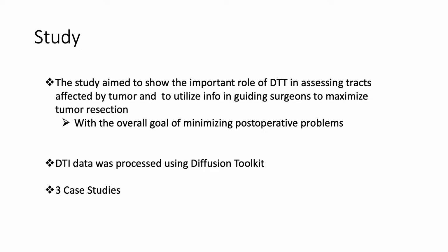The study discussed in the present paper aimed to show this important role of DTT in assessing tracts affected by tumor and to utilize this information in guiding surgeons to maximize tumor resection with the goal of minimizing post-operative problems, whether those be tumor resurgence since not enough tumor cells were removed, or issues from removing too much healthy white matter tissue. DTI data was processed using a diffusion toolkit, which is a free software that can be found online. It was completed by extracting imaging from 3 case studies.